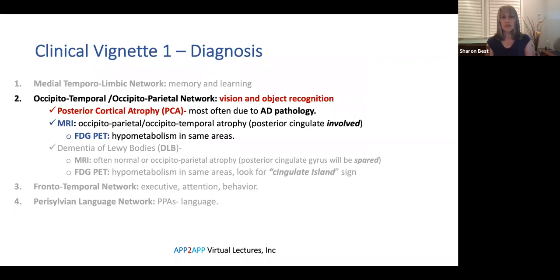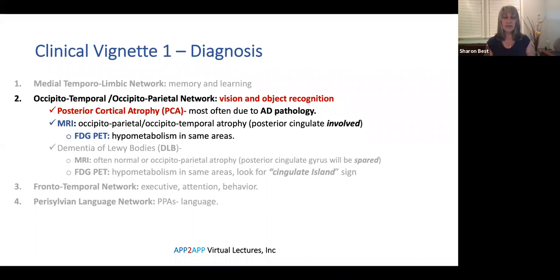So we have a diagnosis: posterior cortical atrophy, and we would expect Alzheimer's disease pathology. We knew this because on FDG-PET there was involvement of the posterior cingulate gyrus — whereas in dementia with Lewy bodies the posterior cingulate gyrus would be completely spared, which has a special name called the cingulate island sign. So if we were in between PCA and DLB, the FDG-PET can be very helpful to make the distinction.